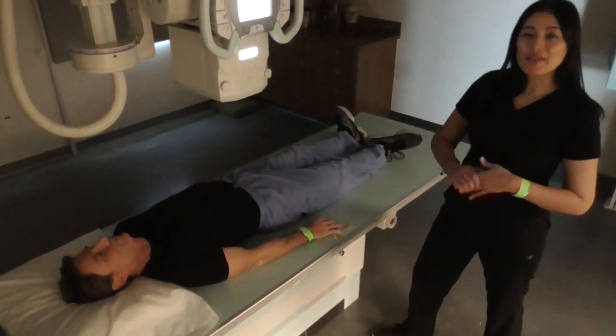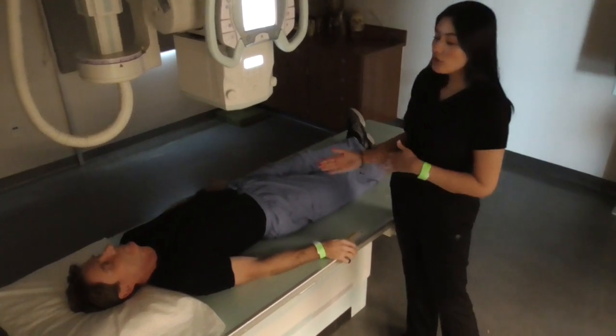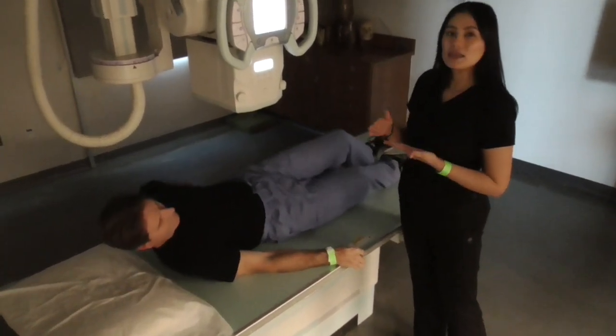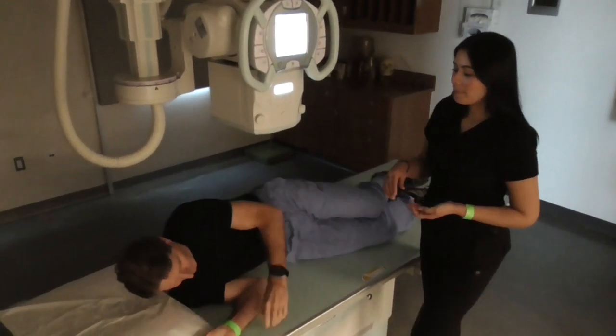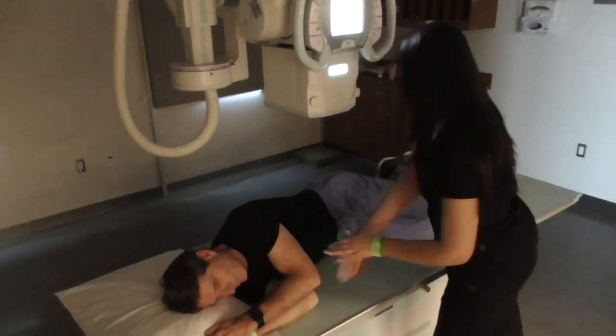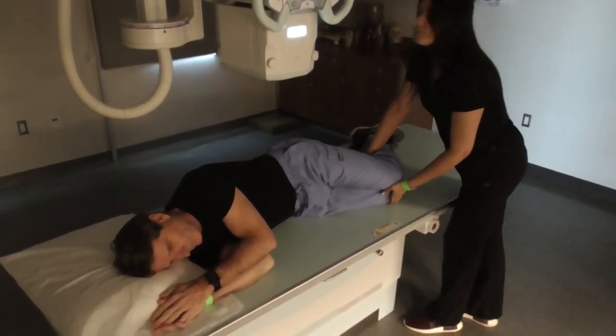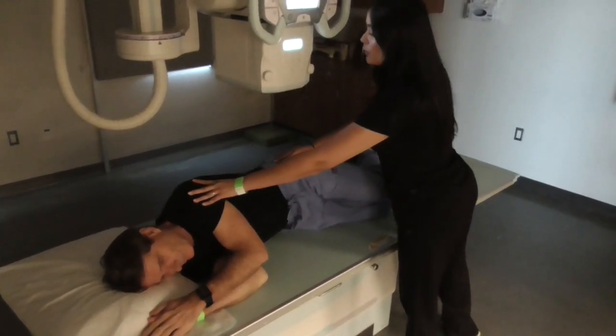We will be centering at the level of the iliac crest. I'm going to have my patient turn onto his right side in the lateral position. Making sure both arms are up and out of the way. The knees are bent.